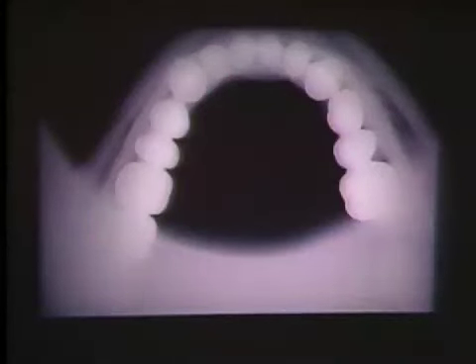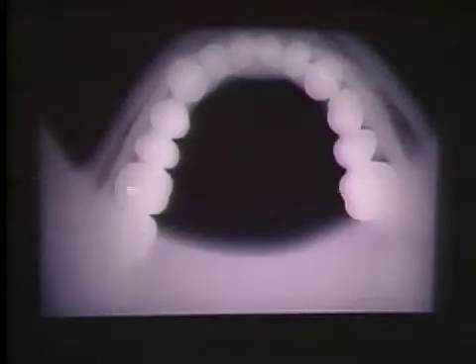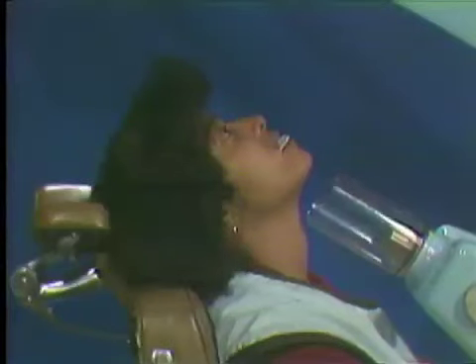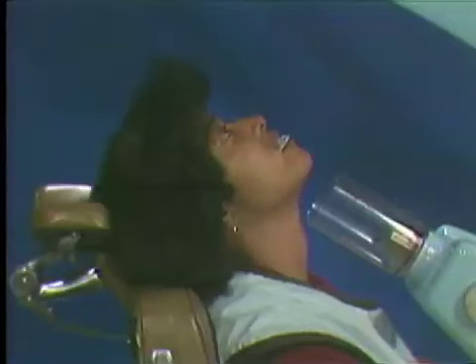Cone cutting is not uncommon with this type of radiograph. To avoid cone cutting, the point of entry for the central ray must be opposite the first molars, along the median line under the chin. The ease of doing this depends on the degree of backward tilt of the head and the size of the neck. The patient is asked to close the lips before the exposure is made.